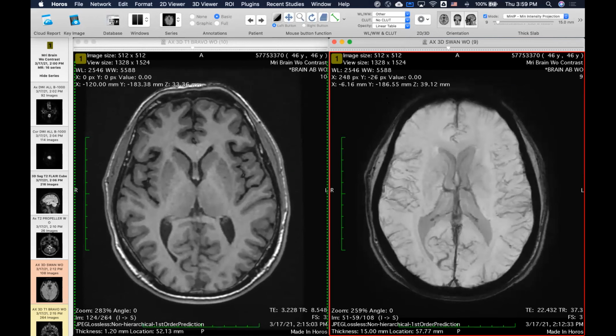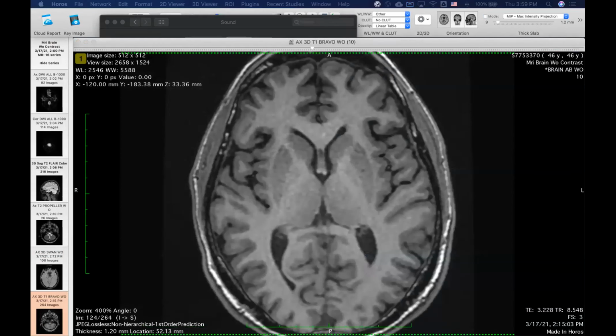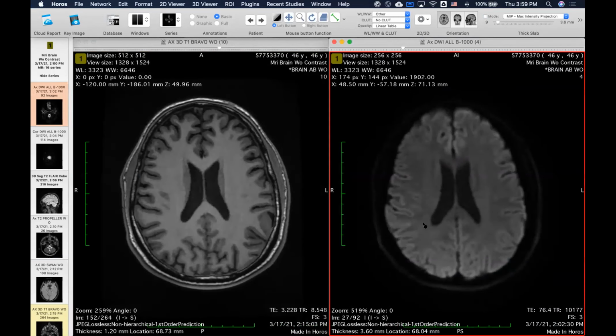Yeah. Okay, next one, I want to show you diffusion. So the diffusion one is pretty cool because it is EPI, it's a spin echo EPI. And so this is the image on the right. First of all, a lot of the signal, so diffusion is really a negative contrast. So basically the more diffusion you have, the more decay you have. So there's a lot of diffusion, by the way, in the ventricles in the CSF because it's free water. So they usually have no signal whatsoever.